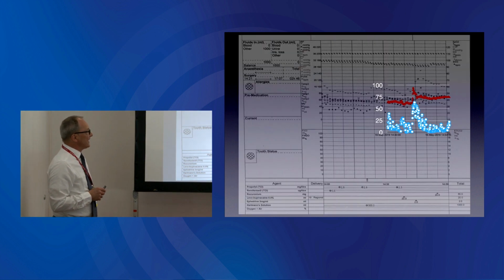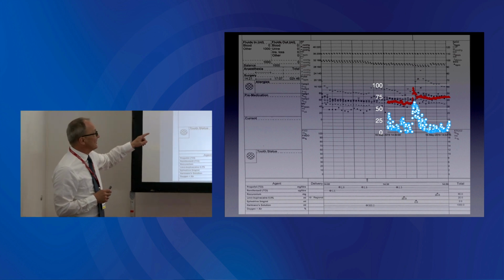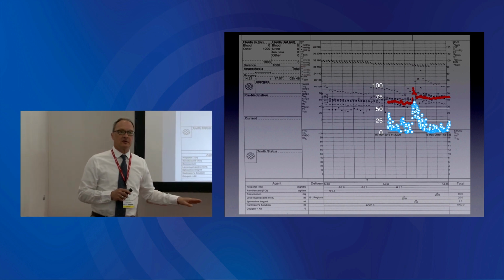And if you overlay the NOL recordings at the same time, you can see that actually the NOL went up as the heart rate went up. So the NOL is very sensitive to pharmacologically induced changes in heart rate.